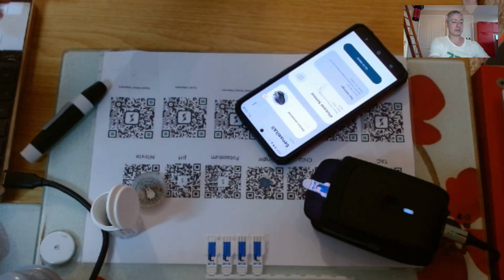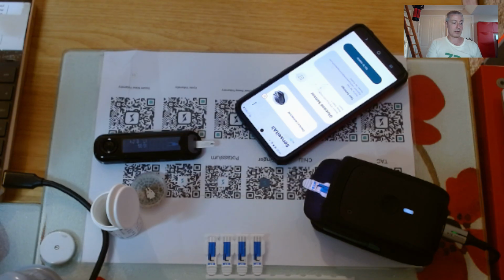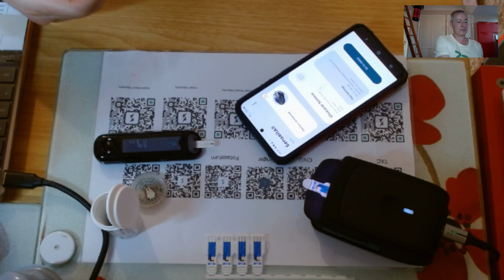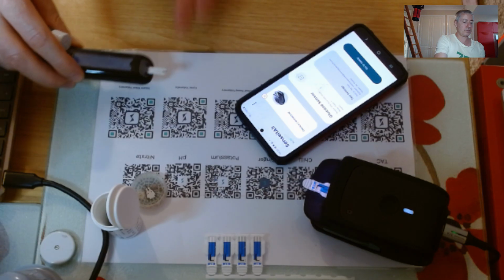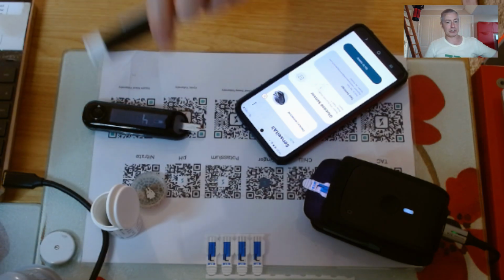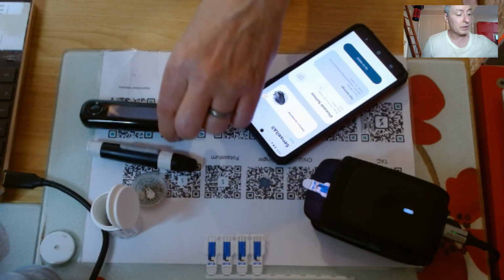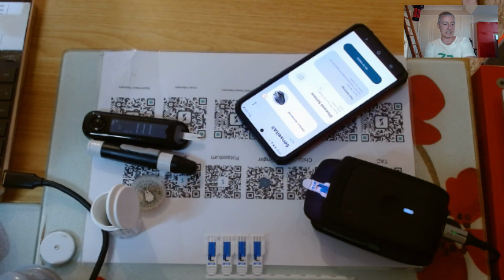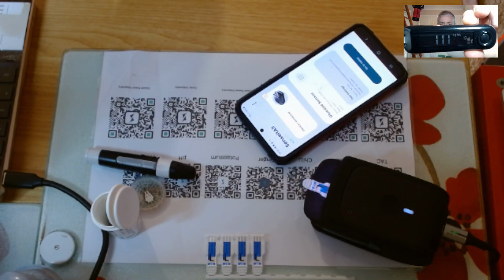You take a glucose strip, you take a drop of blood. Is that glucose strip on? Yeah. You take a drop of blood. Oh, I'm going to love this. Ow. All right, there's my drop of blood. Good thing about electrochemistry is it can be quick, so this will be about 5 seconds. And literally, this is how Abbott and Dexcom first did it. So my blood glucose is at 111 milligrams per dL. I know it's a slightly funny unit. Here it goes, 111 milligrams per dL.